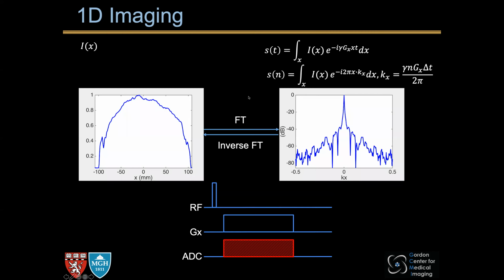Well, the same principle applies, just that the sum of the contribution of signals at each voxel becomes an integral. Here, this I(x) is the image object function. We have a phase term where the phase changes linearly with the spatial location x. If we discretize things, we can write this signal in a continuous form as the following discretized form.